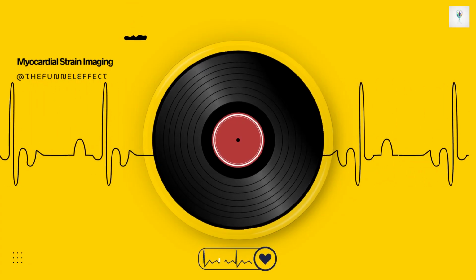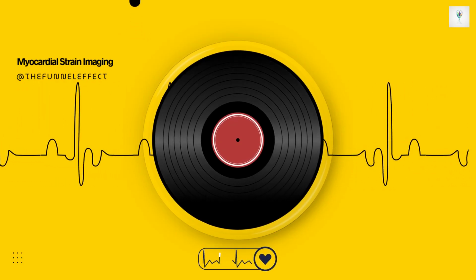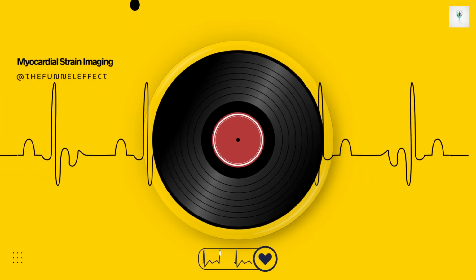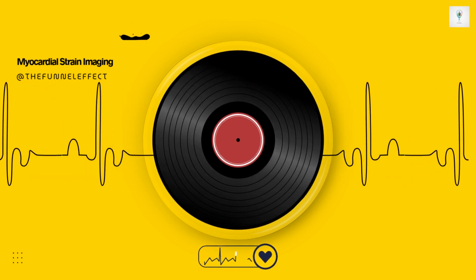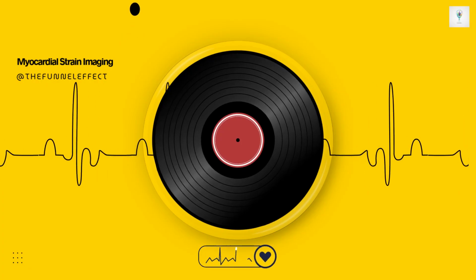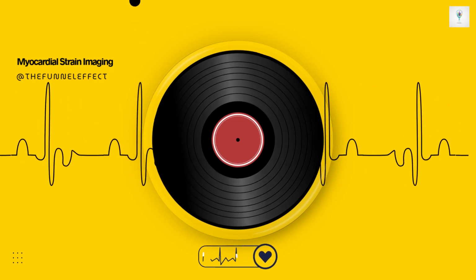This study really underscores why clinicians must record the patient's blood pressure at the time of the strain measurement, and they should actively try to avoid stressful communication during the imaging itself. Because if you see a drop in GLS in a patient you're monitoring, you first have to ask, did their blood pressure go up significantly compared to the last scan? Was the load different? If the load is comparable, then a relative decline of more than 15% from baseline becomes that key pathological threshold we look for, for instance, in cardio-oncology. But you always have to account for load dependency when interpreting changes in GLS.